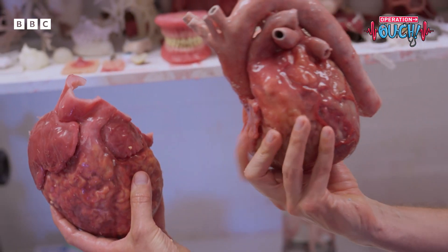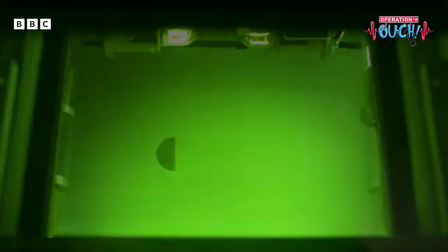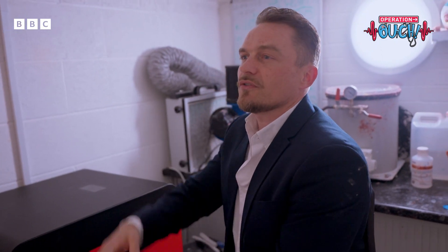But how do you then make the beautiful blood vessels on the top of this one? We use another machine for that — a selective laser sintering machine — which fires a laser beam at tiny particles of rubber to melt them together. And that's how we create the really intricate structure of those blood vessels.